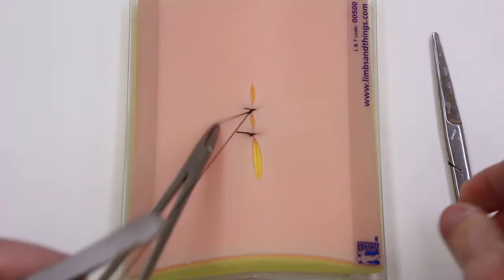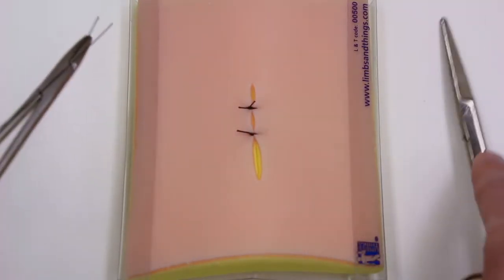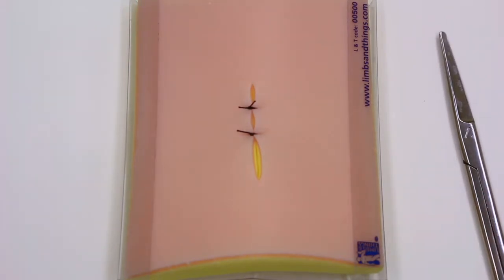I am using silk suture here just because it shows up well, but this is not typically what you'd use to close the skin. Typically you're going to use nylon, proline, some sort of synthetic monofilament.